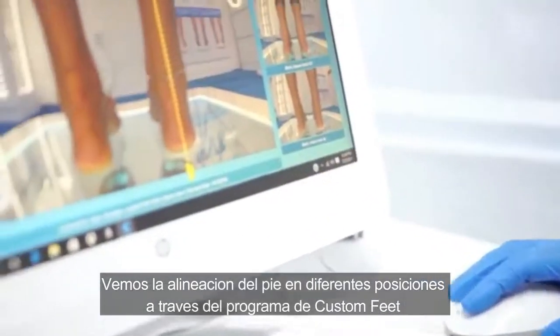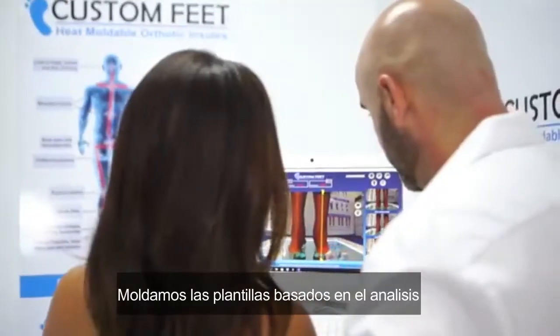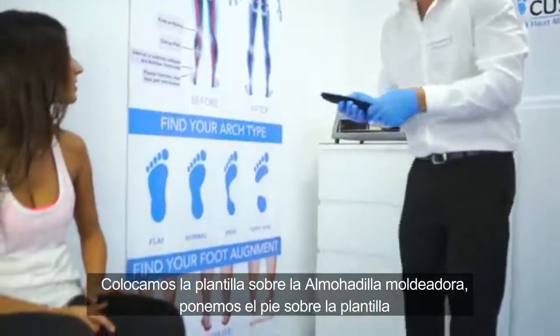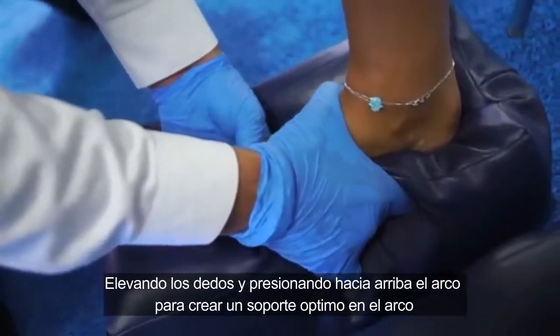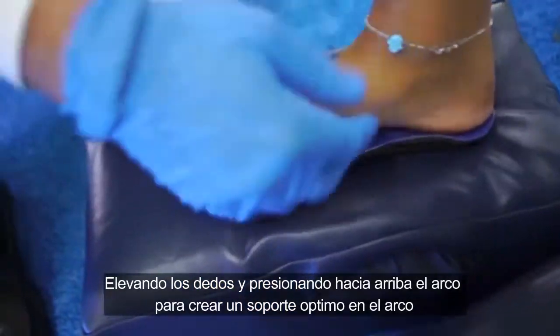We see the foot alignment in the different positions on the Custom Feet program. Mold the insoles based on the analysis. Heat the insoles in the molding oven for three minutes. Place the insole on the memory foam molding pillows. Set the foot on the insole. Raise up the toes and push the arch area up to create the optimal arch support.